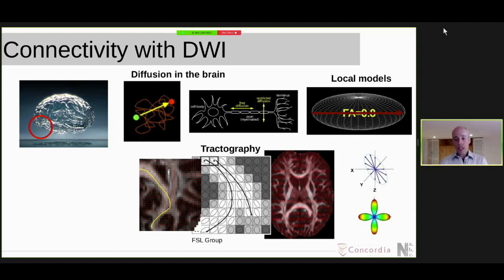And for example, they could take us around the corpus callosum here and then terminate somewhere over here. So I won't get into the details on this, but basically you set a seed point and then you follow along the diffusion direction and compute where that streamline would end, where that proxy for a tract would end.